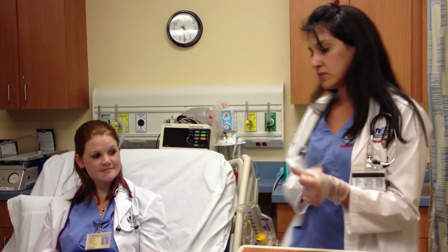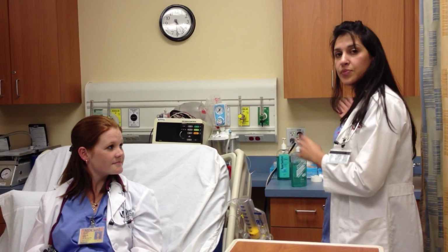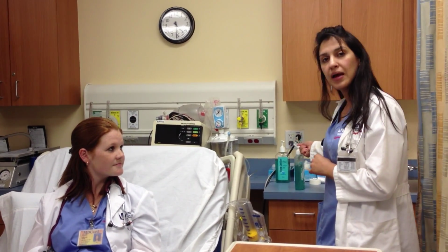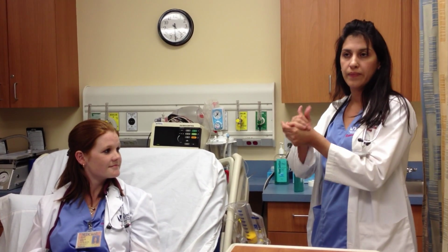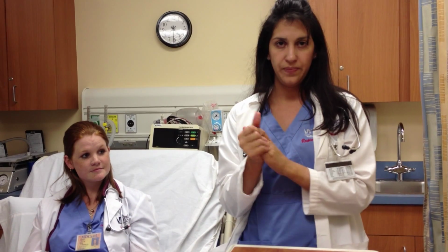Now, since I'm done making sure she understands and she demonstrated back to me how to use incentive spirometry, I will take off my gloves, wash my hands, and in this time I'm going to use my hand sanitizer gel again, making sure it's dry. Now, before I finish, I will make a note. Demonstration and motivation are the most important things for your patient to understand why it's important for her to use incentive spirometry. So motivate her for her efforts.